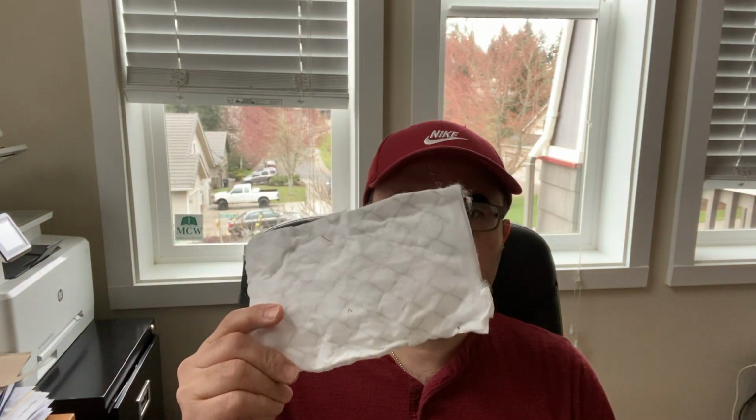So I want to start off with the items that you'll need before we get started. The first thing is you need to go and buy your filter. The one that I have been using and found helpful is this entire home high efficiency filter. I briefly talked about the rating before, but you want something with an FPR of 10 or higher, or a MERV of 13 or higher. Those are the general ones that you'll be able to find out there.